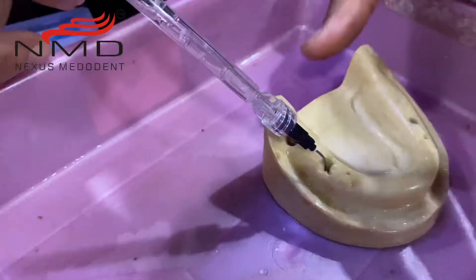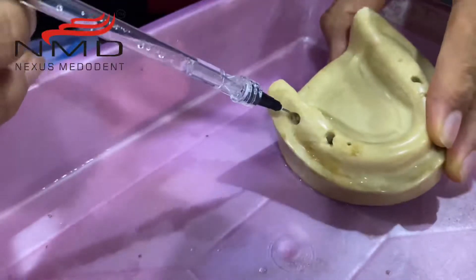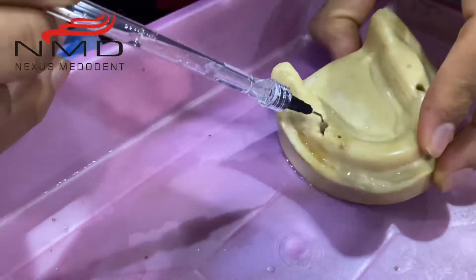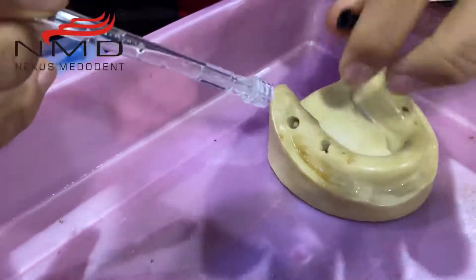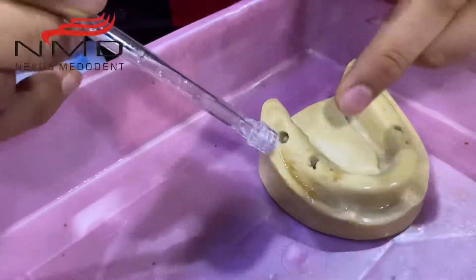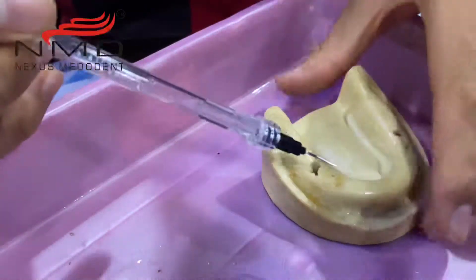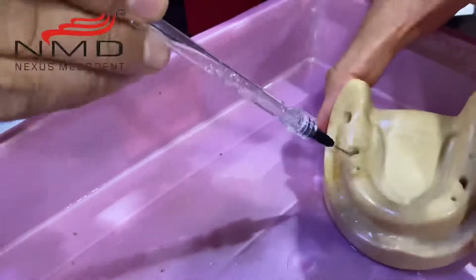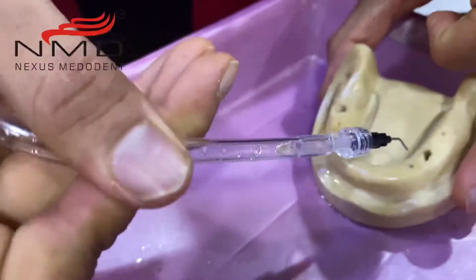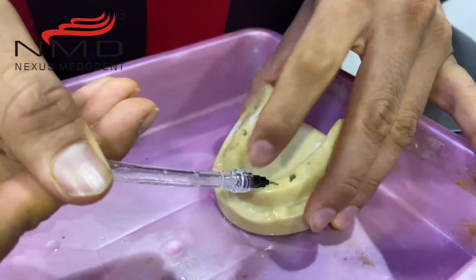I'm going to try it over here — as you can see, I can go in to the full depth and it's going to clean the root canal completely. Anywhere that my regular suction tip cannot reach, because regular suction tip heads are quite broad, where there is a very limited or very narrow opening I can use these attachments and it's going to drain out completely. You can see all the water is coming out.